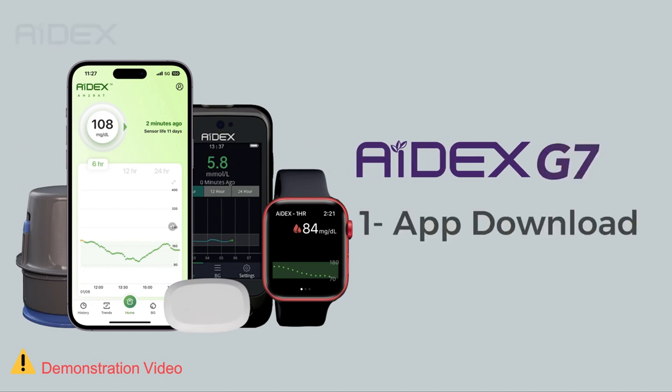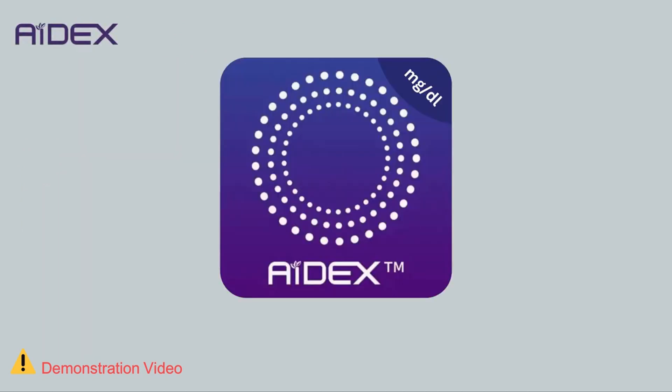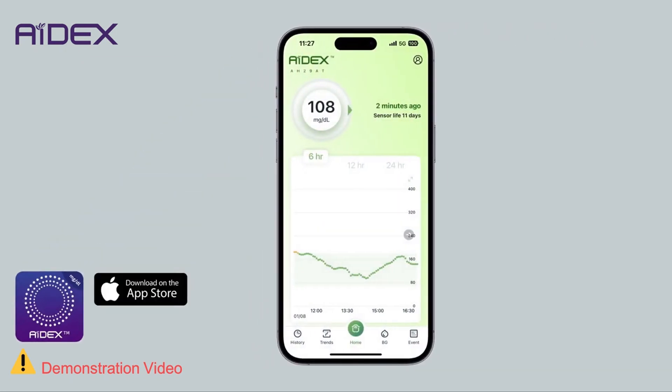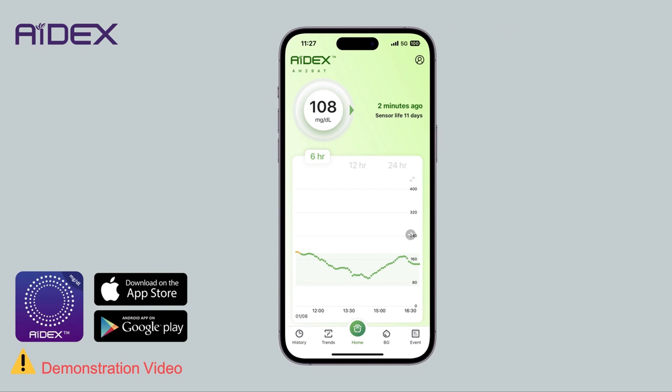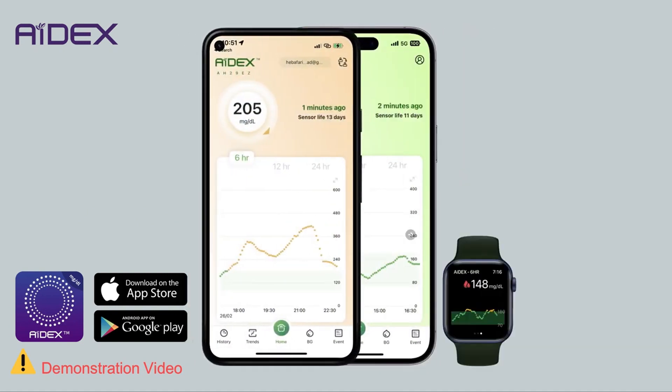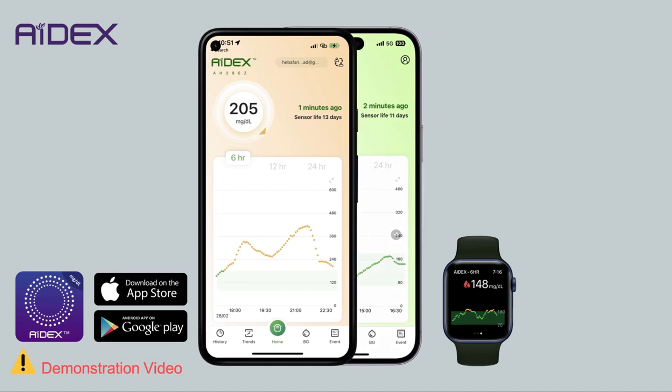Installing 8X Sensor and App. The 8X application is available on the Apple Store for iPhone and Google Play for Android devices. The application is also compatible with smartwatches.